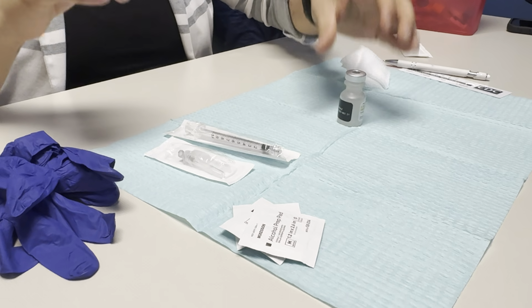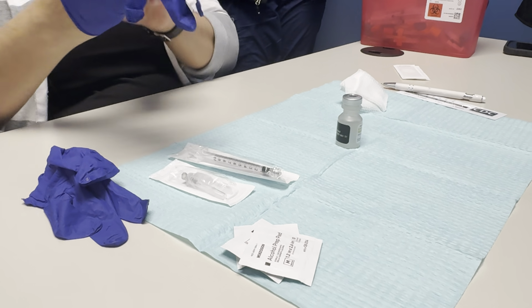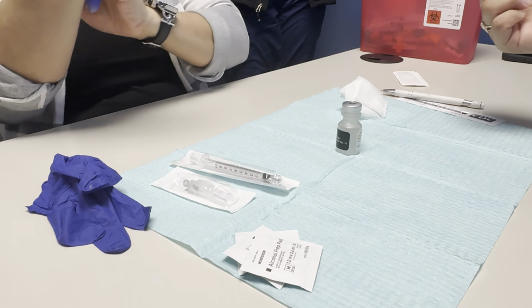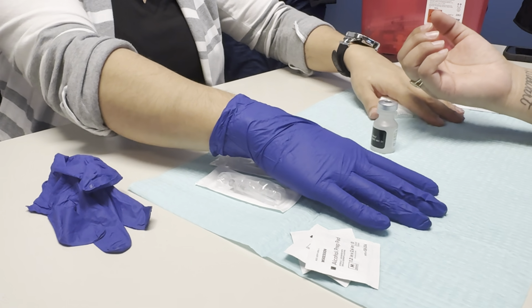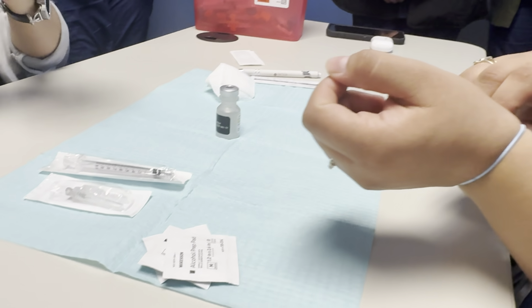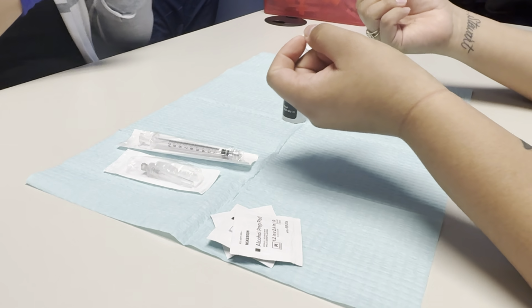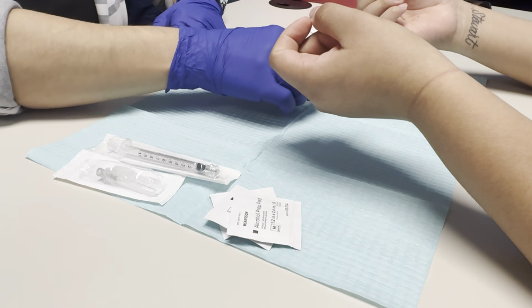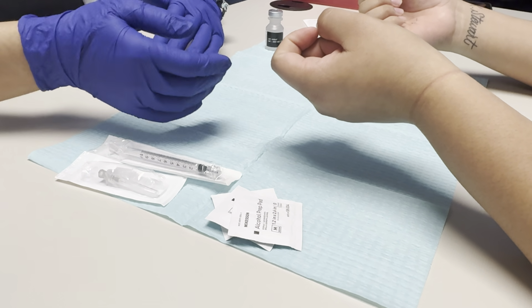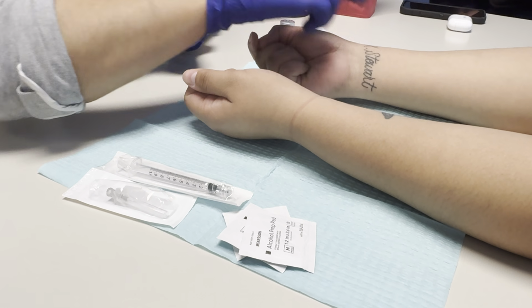Okay. So I'm going to go ahead and ask my patient to bring their arm out. Technically, by law, as soon as they bring their arm out, this is consent that you're allowed to touch them. But I always ask them, is it okay for me to touch you? Awesome. I already introduced myself. I confirm my patient's identification, and my patient knows that they're coming here for a TB screening test. So go ahead and bring your arm out, please. Let's go with your left one.